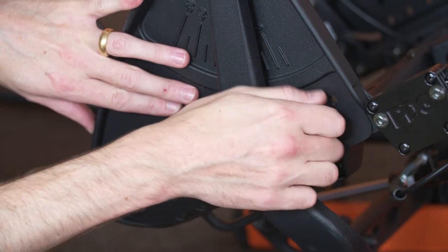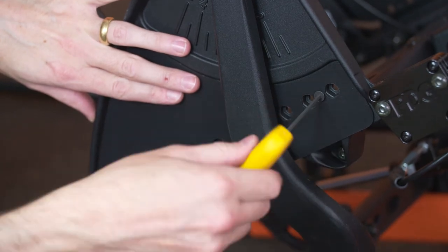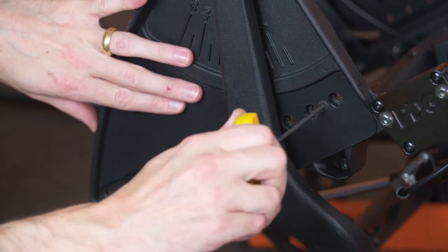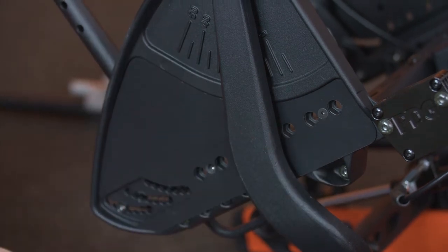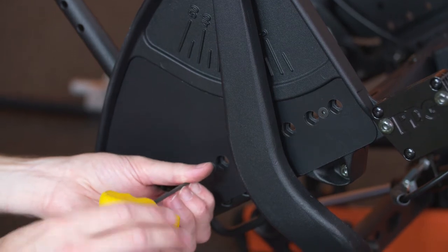If desired, the seat width can be adjusted in increments of one half inch by adjusting only one side of the wheelchair. If adjusting the seat width in increments of one inch, after one side of the chair has been adjusted, repeat the process for the other side of the chair.